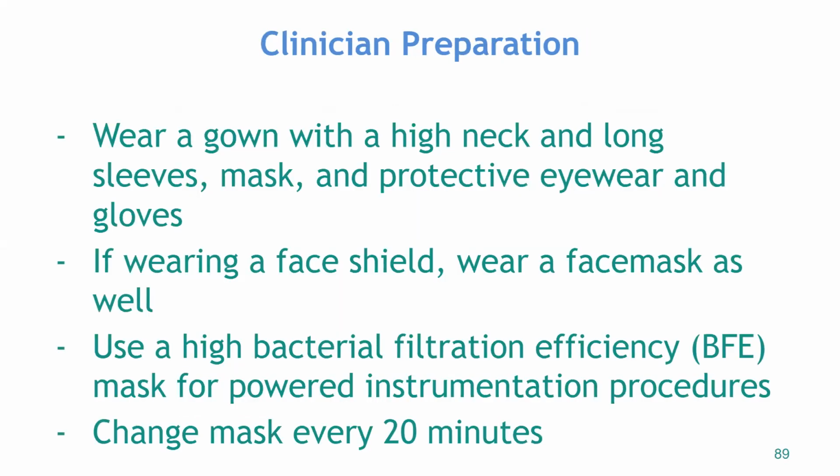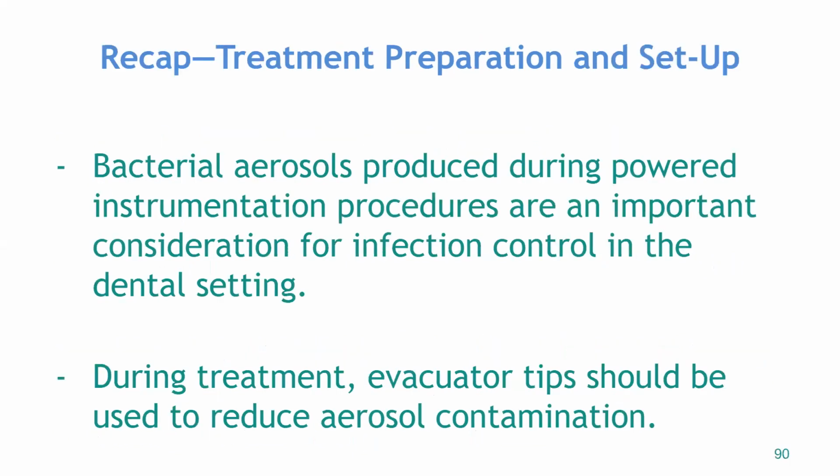Good to know. So it's important that we wear a gown with sleeves, a mask, protective eyewear, and gloves. A face shield is great. And then using a high bacterial filtration efficiency mask for powered instrumentation procedures. And then changing your mask every 20 minutes is the recommendation. That's if you were cavitroning for more than 20 minutes, basically, because it will soak your mask really quickly. But if you're wearing a shield, then your mask is not going to get soiled as quickly.